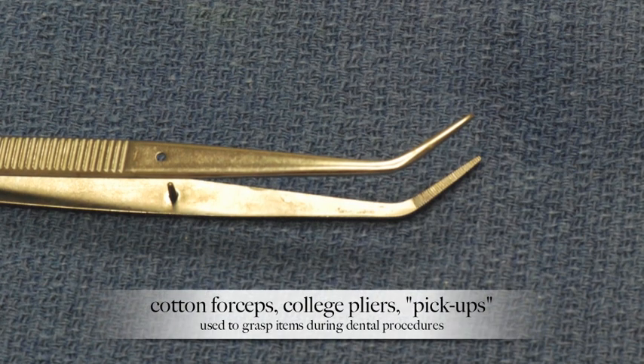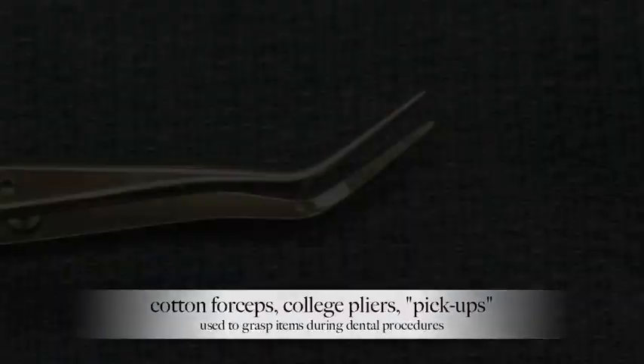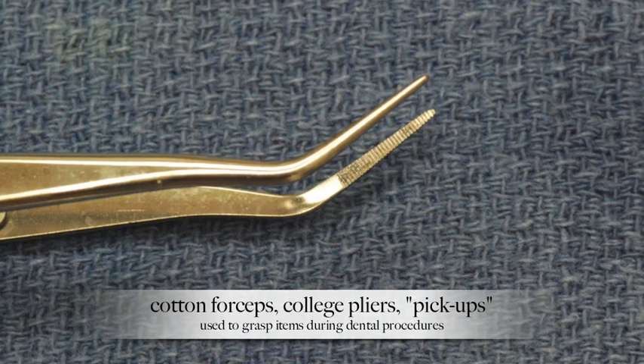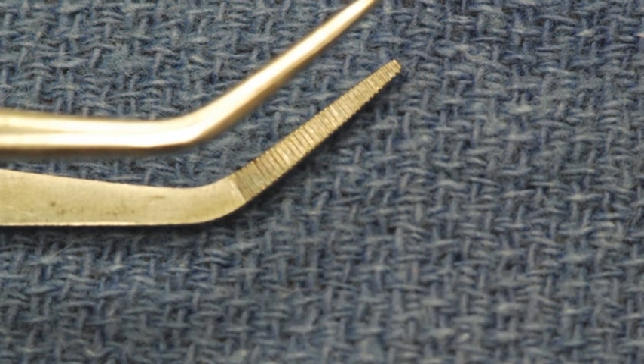The next instruments are called college pliers, also called cotton forceps, or in some circles called pickups. These are a multifunctional instrument and they are used for grasping many small items both outside the mouth and inside the mouth.